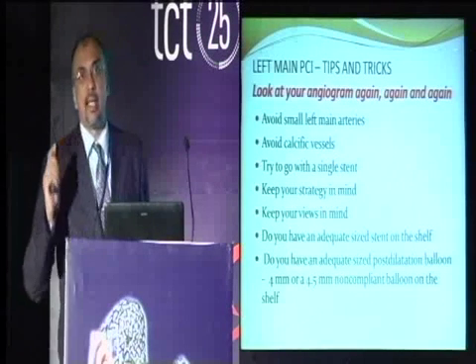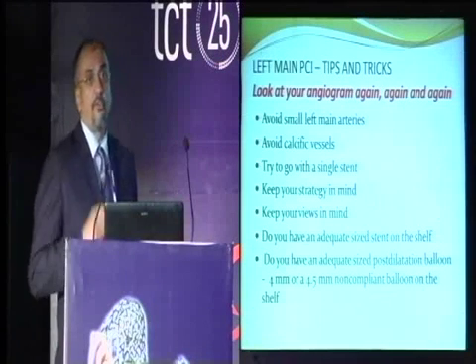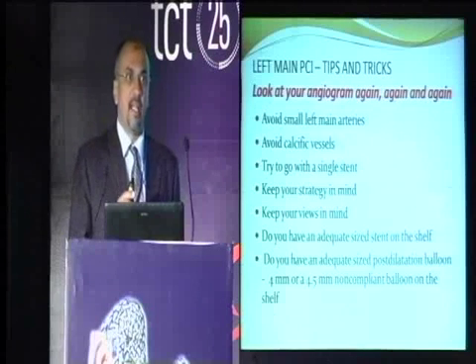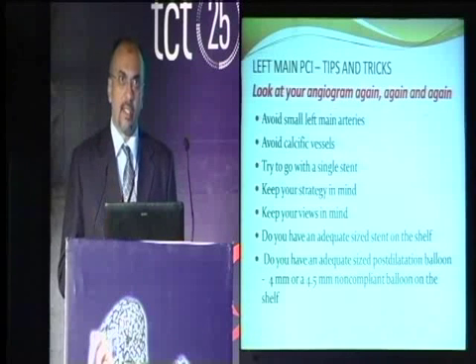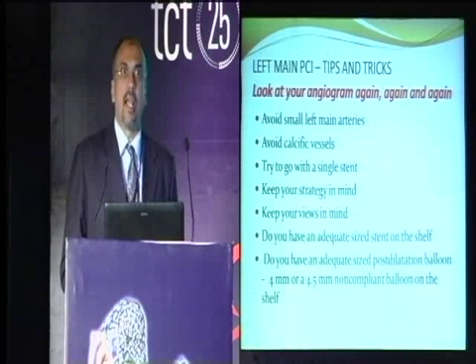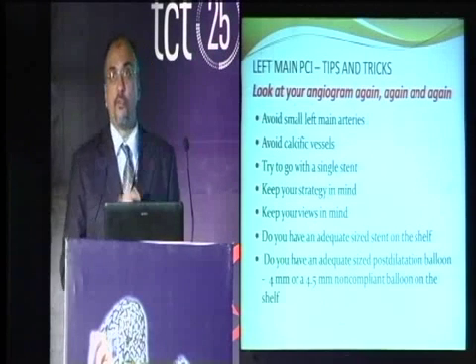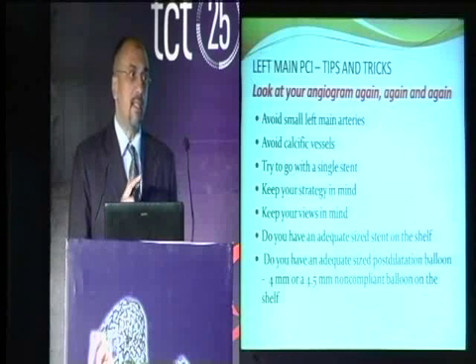Keep an adequate sized stent on the shelf. Make sure you have a 4.5 or even a 5 millimeter non-compliant balloon on the shelf before you go in for an angioplasty. This is so important, as you will see later. If you are unable to post-dilate properly, and if you do not have these 4.5 or 5 millimeter non-compliant balloons, then it's not worth doing it.